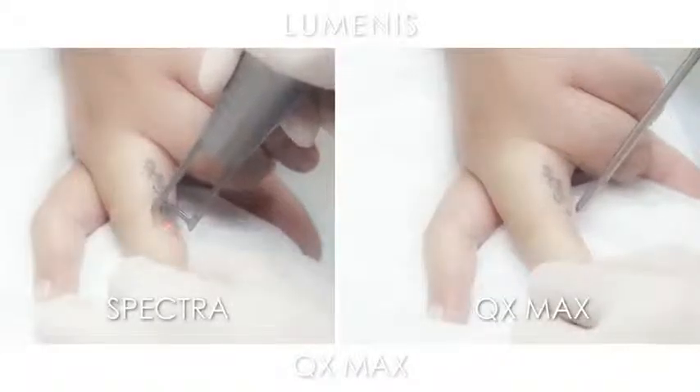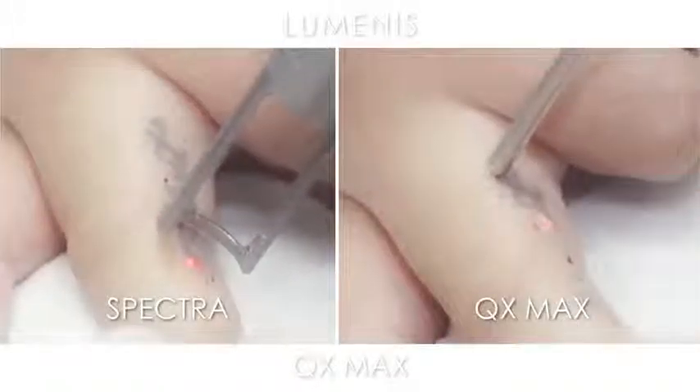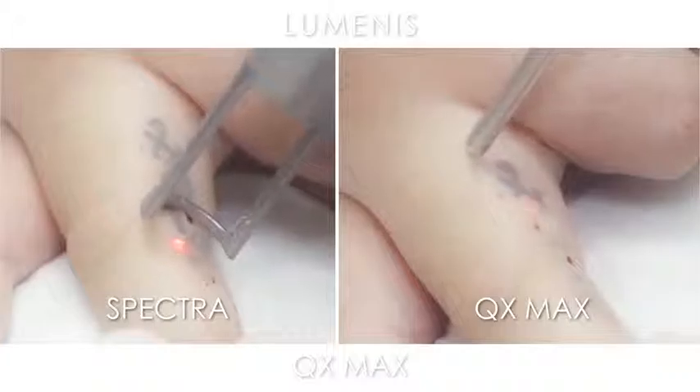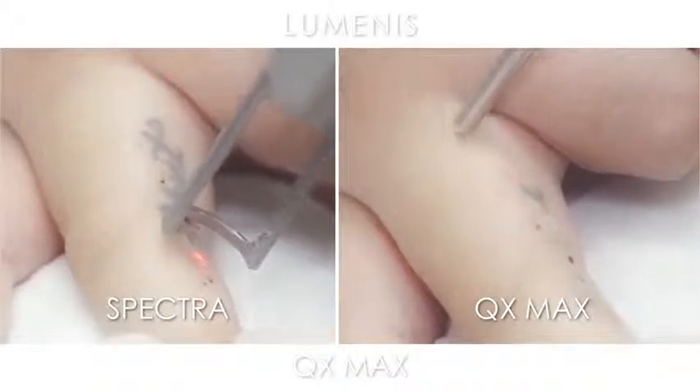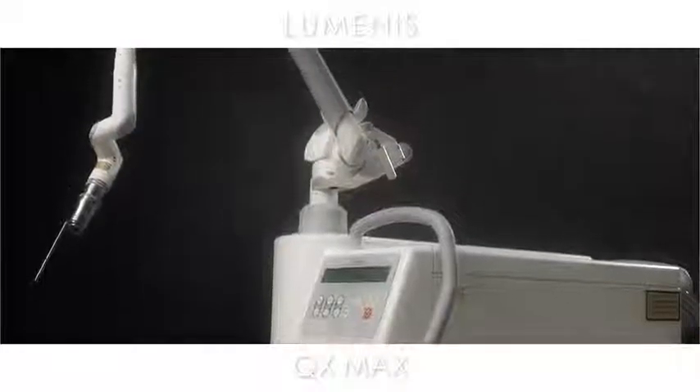It's black ink, it's there on my skin, so it's going to take several treatments to get rid of it. It's better than having it for the rest of my life. You have multiple wavelengths at your disposal that can target a wide range of indications, a wide range of tattoo colors — a one-stop shop for your patients.